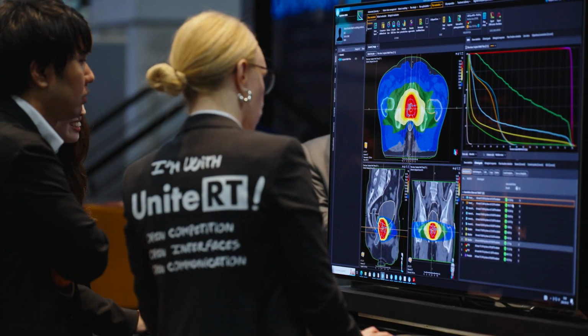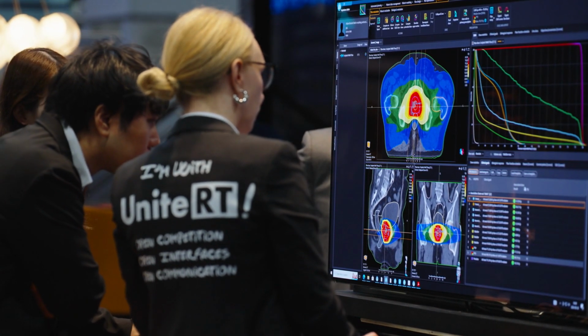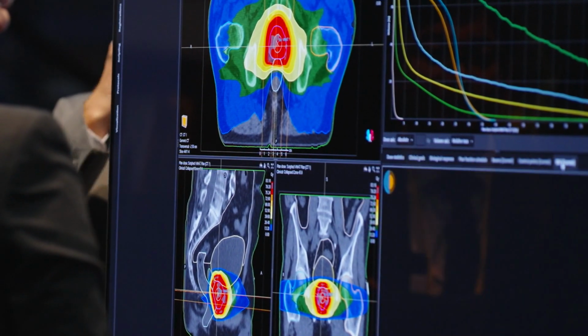Basically, you have a patient coming in, and you know what tumor it is and what stage, and everything. You know the ICD codes, for example. When the images have been acquired for that specific treatment site, they go directly to the planning system, to RayStation. We process those images, segment them, generate the target volumes, and generate the protocols based on what the clinic has specified should happen for this specific patient case.